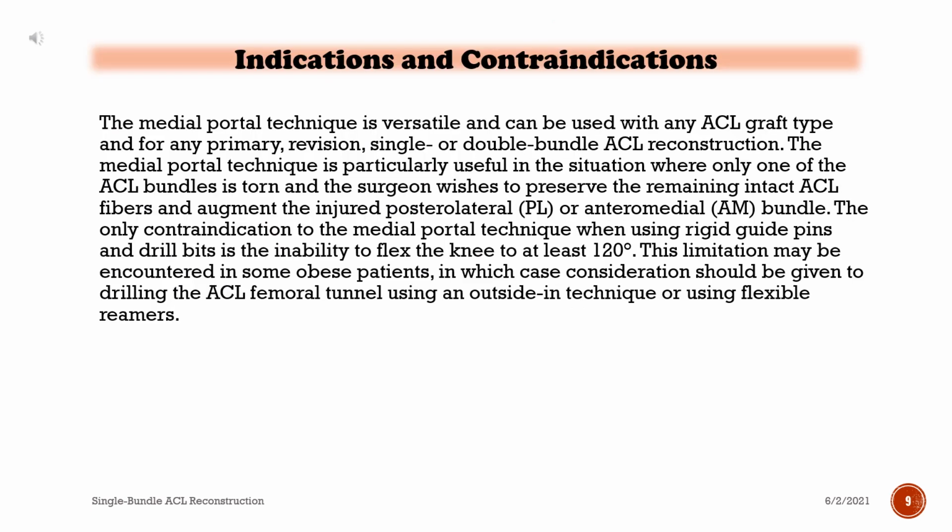The medial portal technique is versatile and can be used with any ACL graft type and for any primary, revision, single or double bundle ACL reconstruction. The medial portal technique is particularly useful in the situation where only one of the ACL bundles is torn and the surgeon wishes to preserve the remaining intact ACL fibers and augment the injured posterolateral, PL, or anteromedial, AM, bundle.